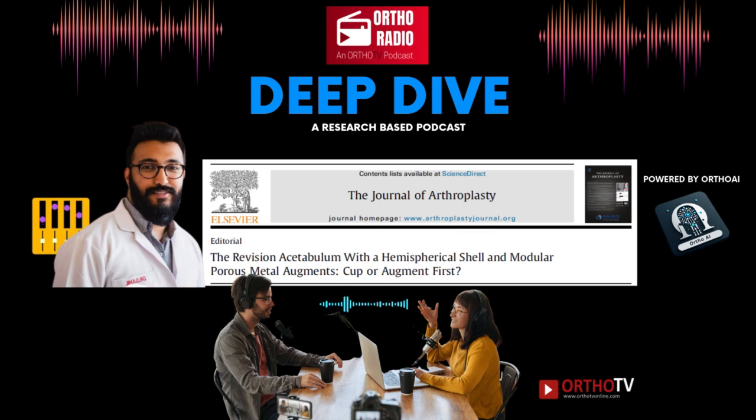Exactly. So we've been talking a lot about augment first. When would a surgeon choose augment second? Augment second is really useful for posterosuperior defects, which means bone loss in the back and upper part of the socket. I see. This area can be weak.